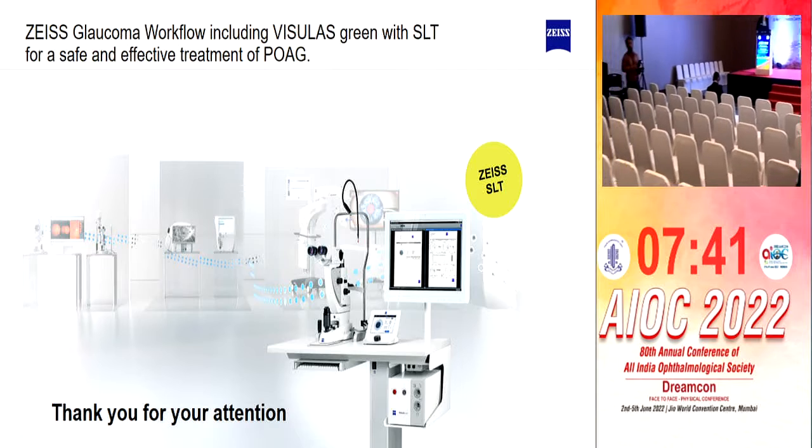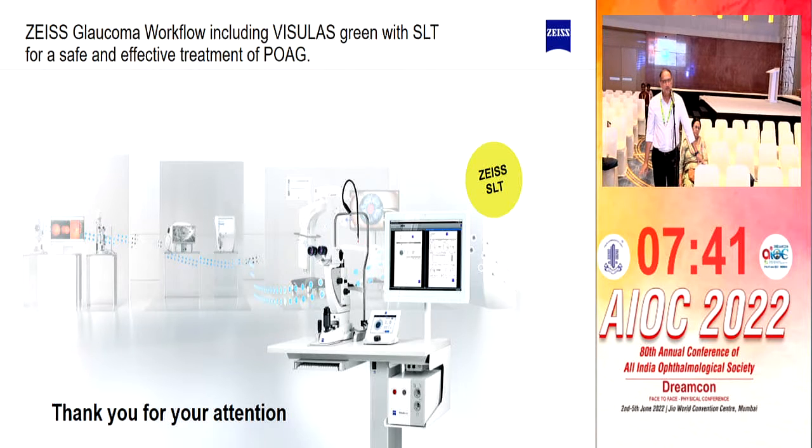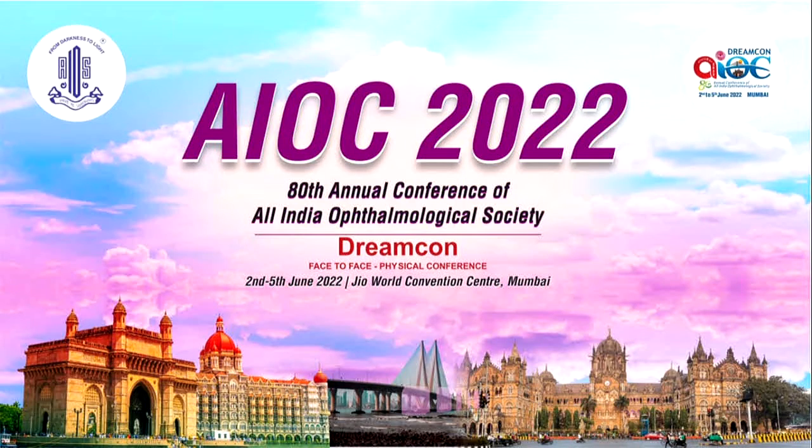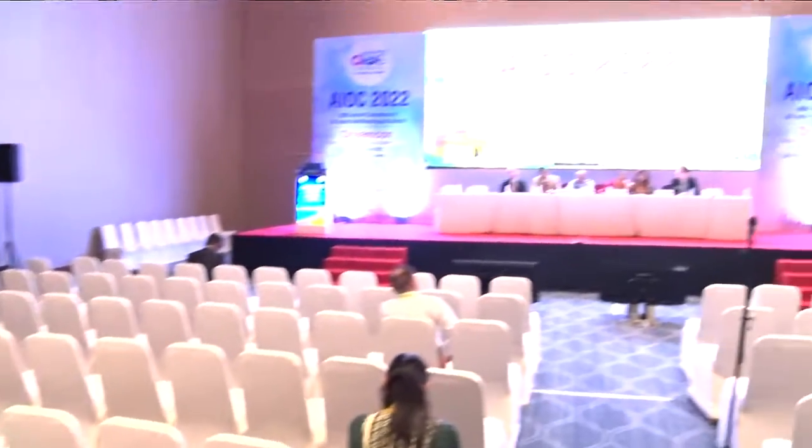This is for Dr. Shefali. While we are determining progression in very advanced cases, structure is very difficult to define progress. Subjectively, on perimetry, where it matters the most, it fails because of the high variability. So what I feel, do you advocate diurnal variations, which is one of the pointers for a failing advancing case in higher advanced glaucoma? Diurnal variation test? See, if the patient is progressing despite the normal pressures, then definitely diurnal variation test has a role. And in advanced glaucoma, as you said, yes, the role of structure is less. We can do 10-2, and that too size 5, as Dr. Sunita also said. And we can assess with macula size 5.